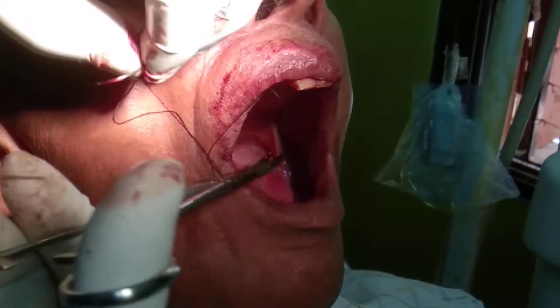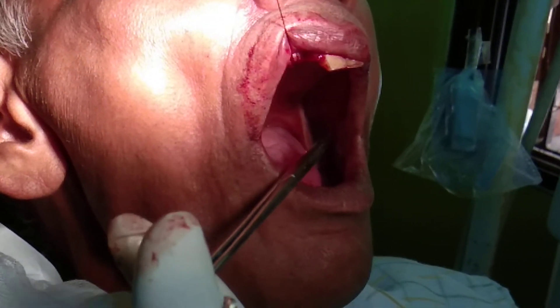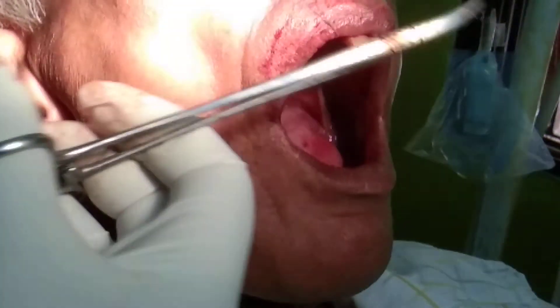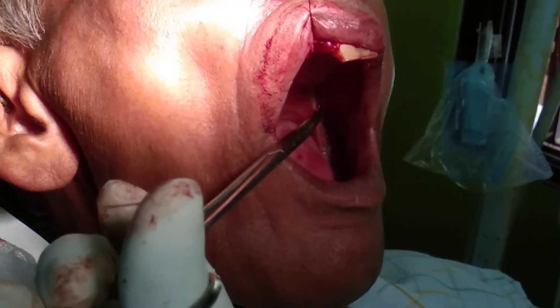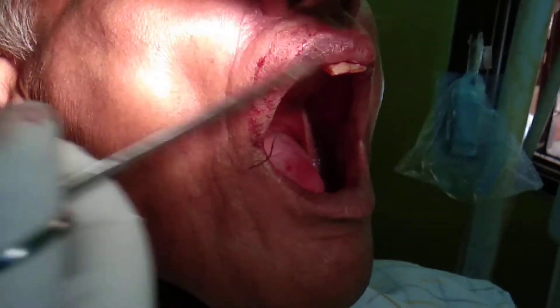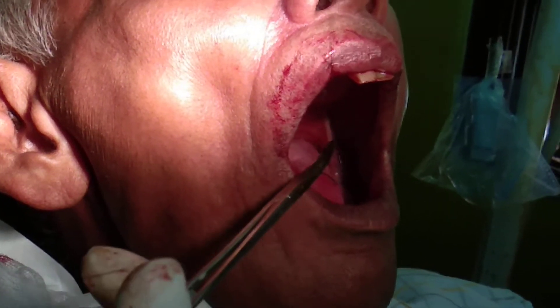The first knot should be loose. The second and successive knots are going to be stronger. Why? Because if your first knot is tight, you can actually tear the gum — you can tear the flap — which can lead to further bleeding.